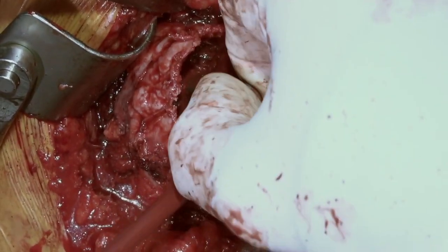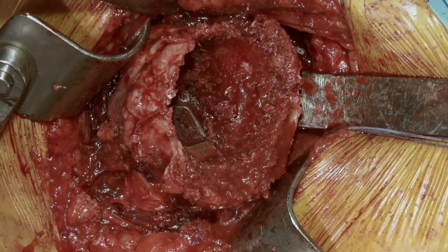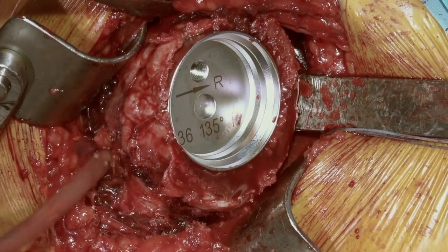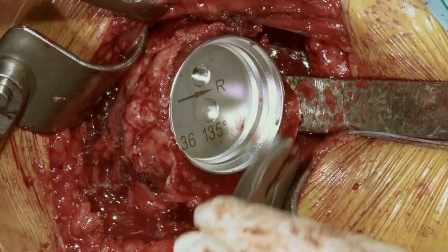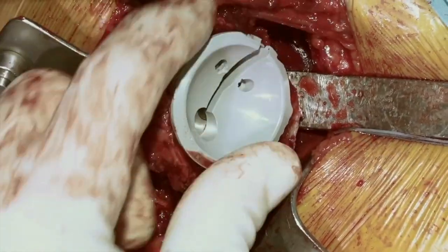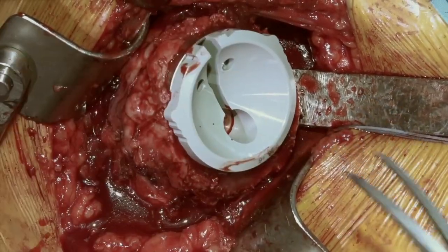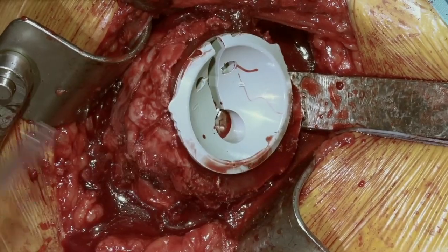We'll take out our guide and then take the actual cup and put it in place — 135-degree inclination, 36 cup, displaced 2 millimeters to the right for our offset. This sits in nicely with respect to the bone. We'll start with our smallest trial because it looks like this will be in a good position for a plus 3. We have the ability to trial a number of different sizes. We have a plus 6 as well. It's very easy to take these out and put them back in. These trials are fixed in position, so we can do a much better reasonable trial of our system with these instead of pieces that move all over the place.